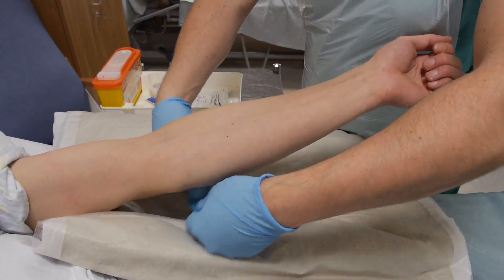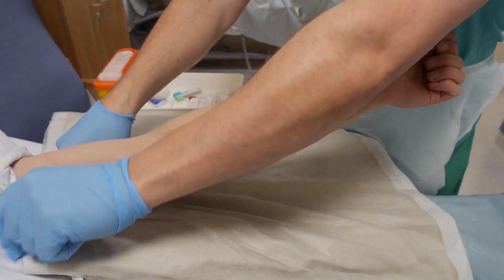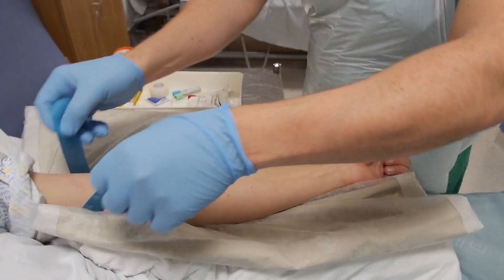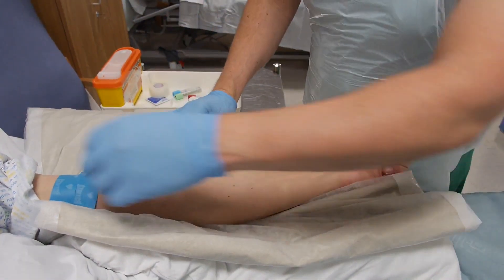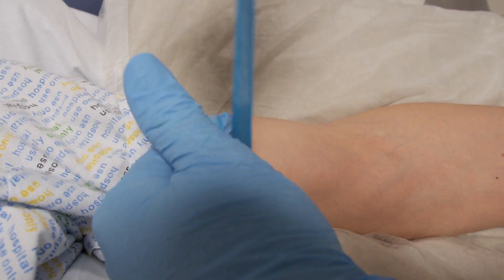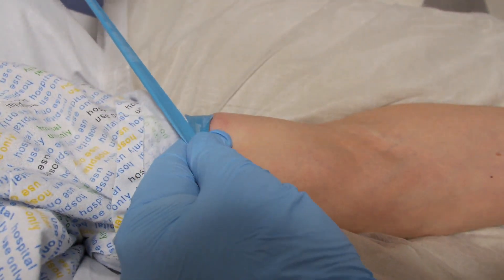Apply a tourniquet to the upper arm. This facilitates vein identification and needle entry. Placement should be approximately 10 cm above the insertion site.